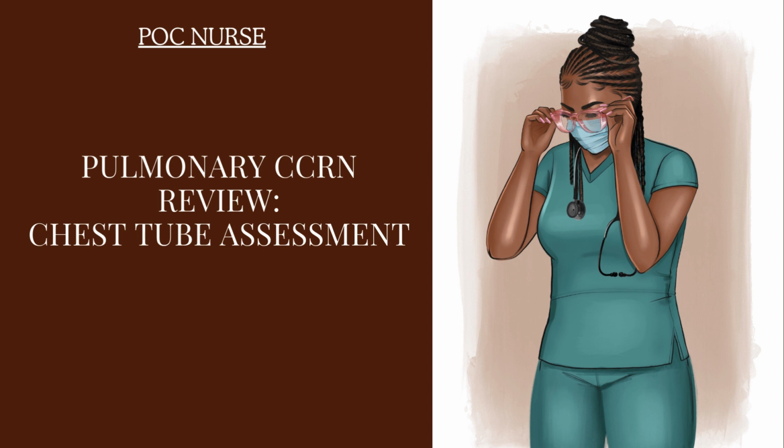We want to monitor or assess the dressing site, the insertion site. We want to make sure that it is clean and dry. If there's any drainage, we want to take note of the drainage. You also want to monitor that insertion site for signs and symptoms of infection, such as redness, warmth, etc.